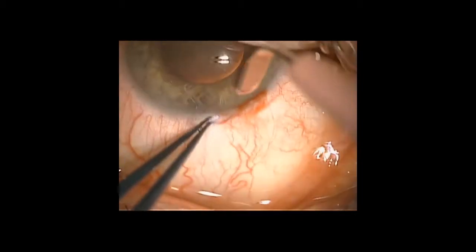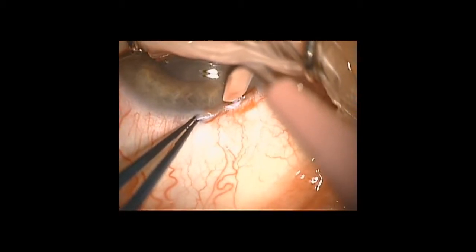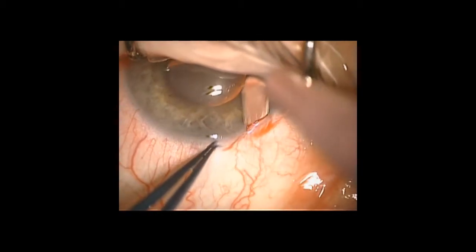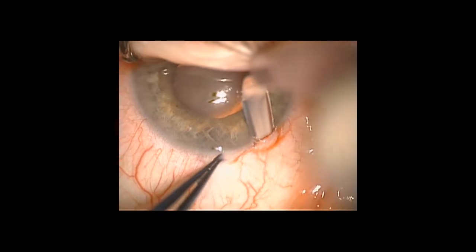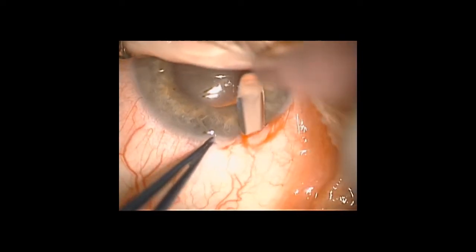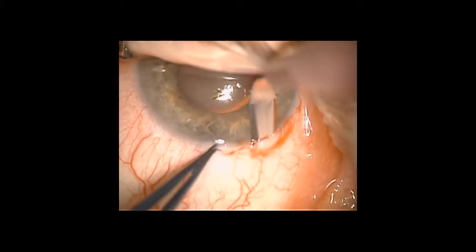To facilitate the creation of an intrascleral pocket, as demonstrated in this video, it is essential that the eye is held firmly with the non-dominant hand to provide adequate countertraction to facilitate this aspect of the surgery.